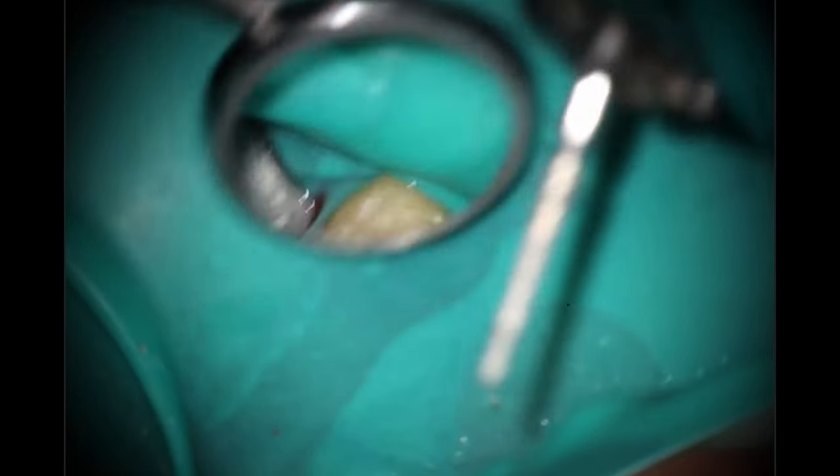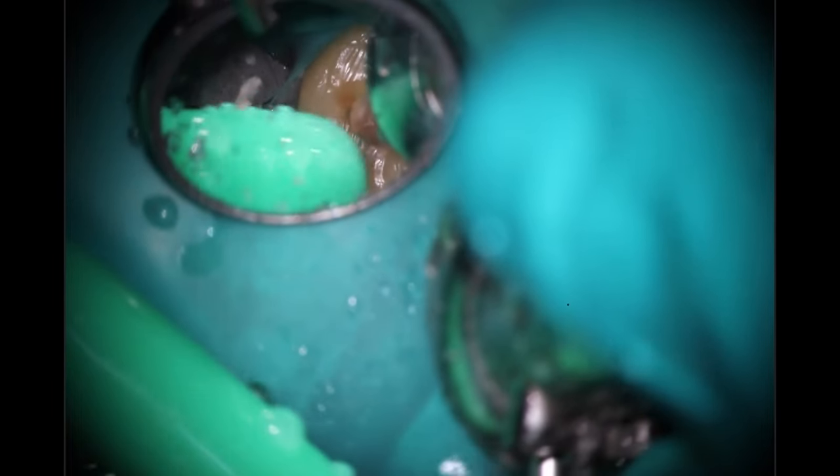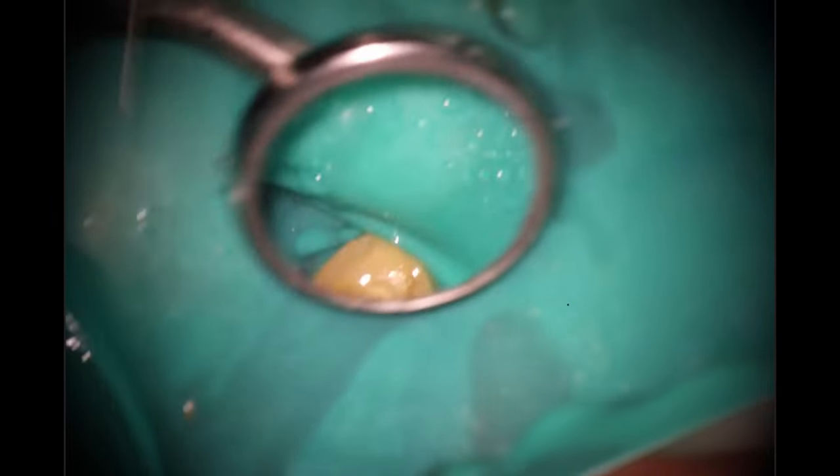You can see that white spot there — I thought it was potentially IRM, but I think it was whatever cement was on the existing crown there. You can see it flaked off pretty quickly. So what I'm going to do is just do an access here to pick up my MB and distal buccal — kind of a truss style access. If you're familiar with that on lower molars, you can do something similar with upper molars. I like the idea of using a decay approach to access: follow wherever the caries is, use that to differentiate where your access is going to be.